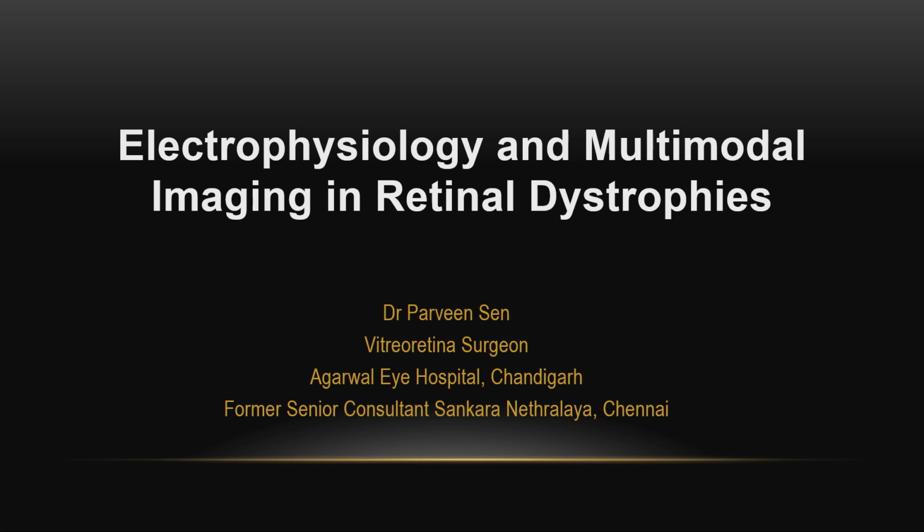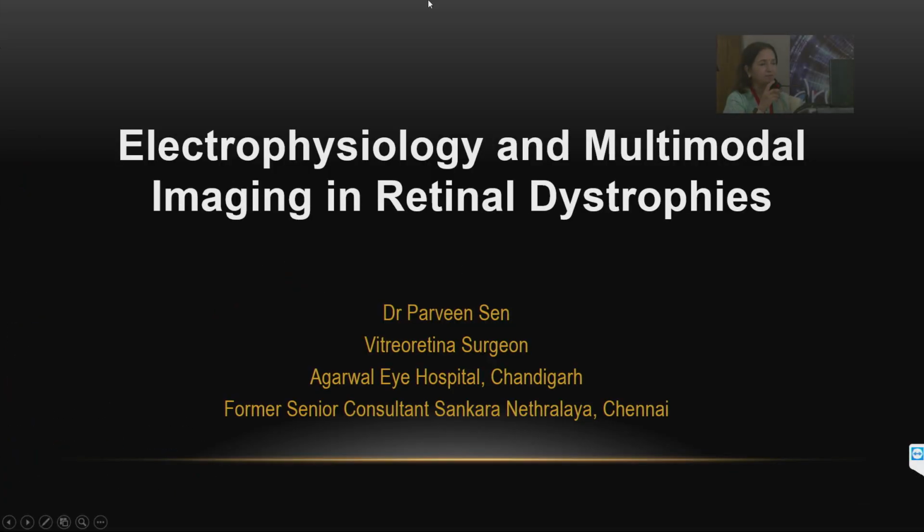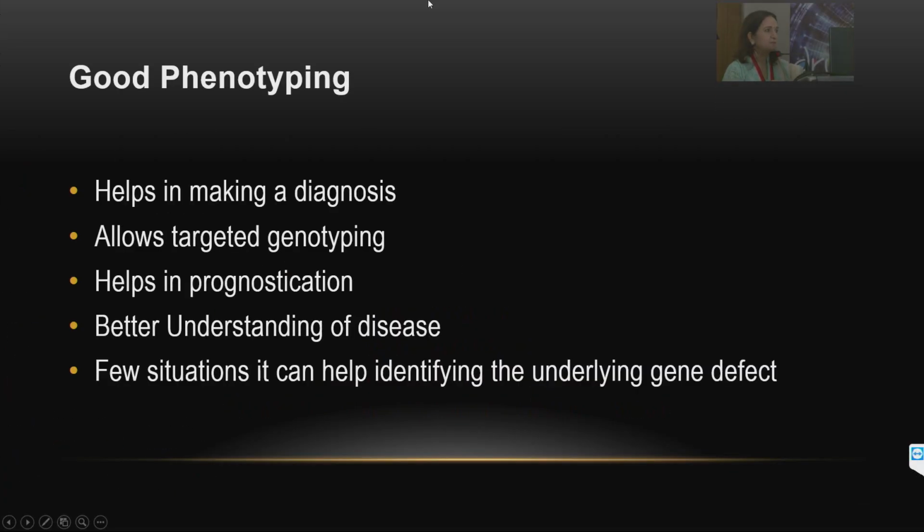Yeah, so I'll be talking on electrophysiology and multimodal imaging put together for retinal dystrophies. So why should most of us have this? First question is, why should we be doing any investigation whatsoever for retinal dystrophies? Because there is no treatment. But it does help in making a diagnosis, helps in targeted genotyping, helps in making a prognosis and explaining it to the patient for better understanding of disease.